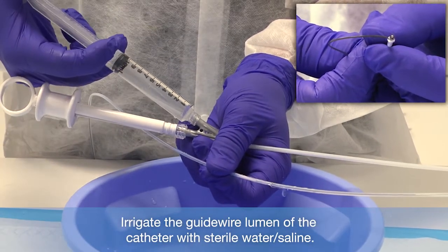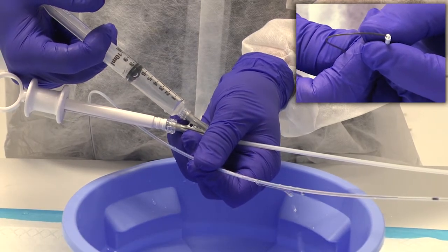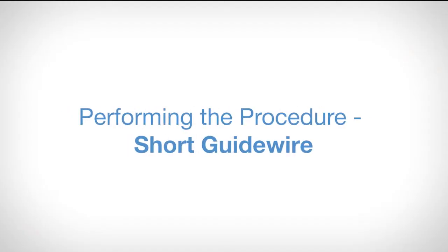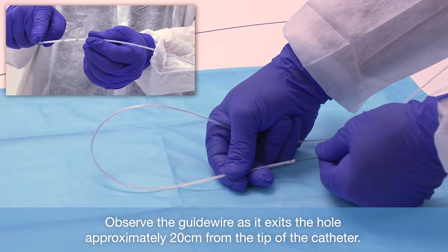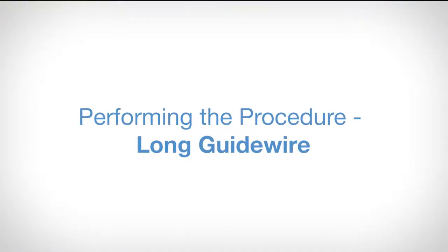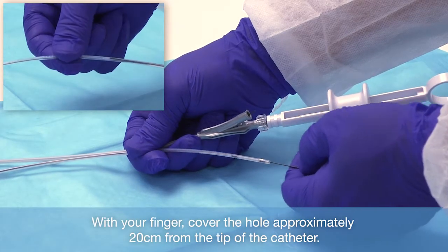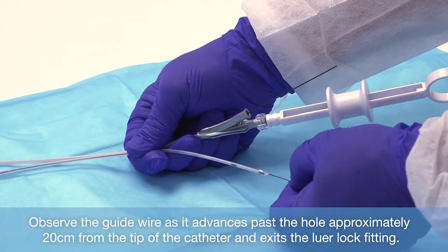Irrigate the guide wire lumen of the catheter with sterile water or saline. When using the device with a short guide wire system, allow the guide wire to exit the hole at approximately 20 centimeters from the tip of the catheter. Bending the catheter slightly will help to find the hole. If using the device with a long guide wire, cover the hole at approximately 20 centimeters from the distal tip, advance the guide wire past the hole and through the lure lock fitting at the handle of the device.